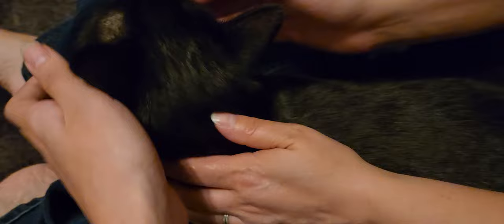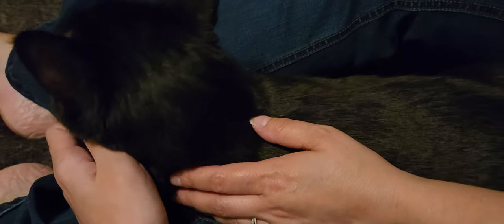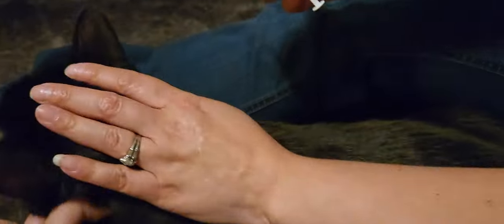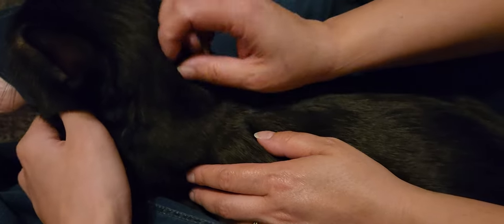This is Max, and Max has to have an insulin shot. So we have an insulin shot ready. My handy partner here — we're gonna teach you guys, as pet owners, how we give Max his insulin.